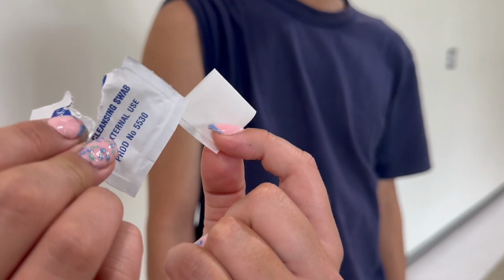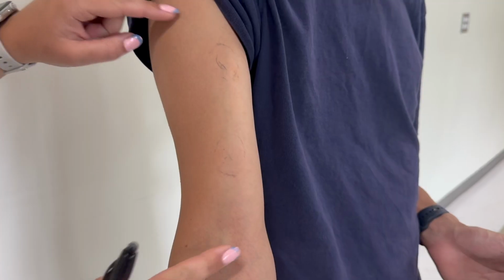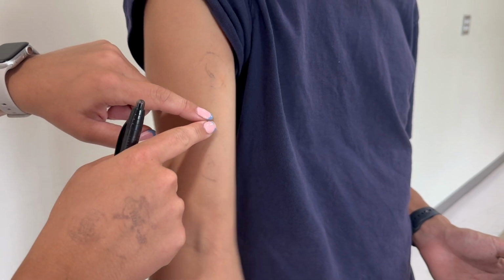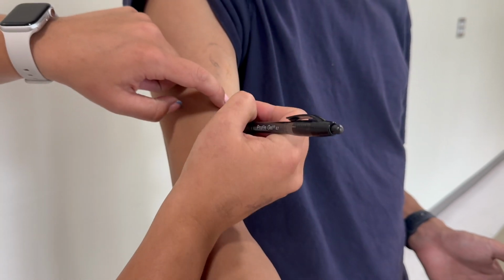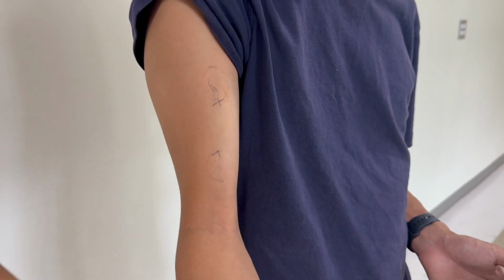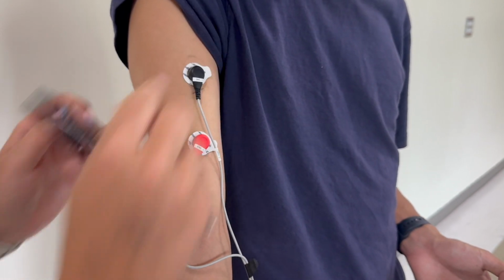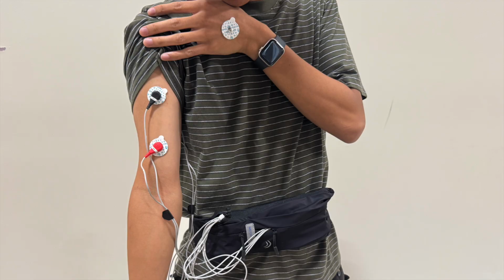To set up the EMG system, the user must first prepare the skin using alcohol pads. Disposable gel pads connected to electrodes should then be placed along the longitudinal midline of the target muscle as close to the anatomical midpoint as possible. A differential signal is obtained from the positive and negative electrodes for each channel. The system supports different channel configurations based on the user's needs.